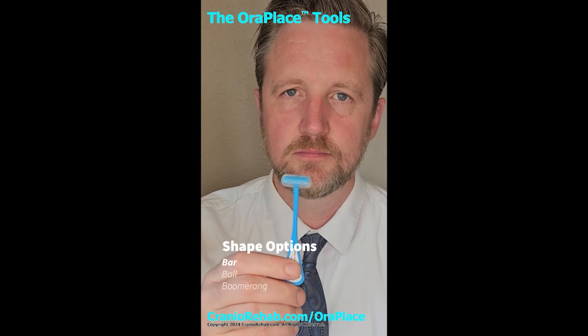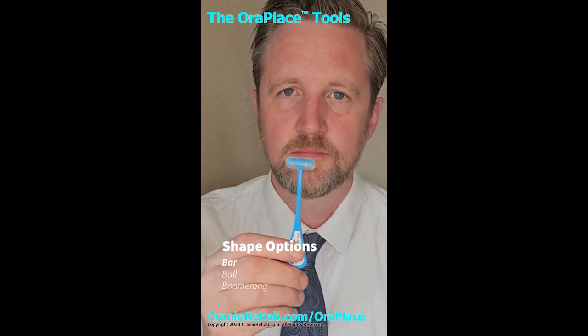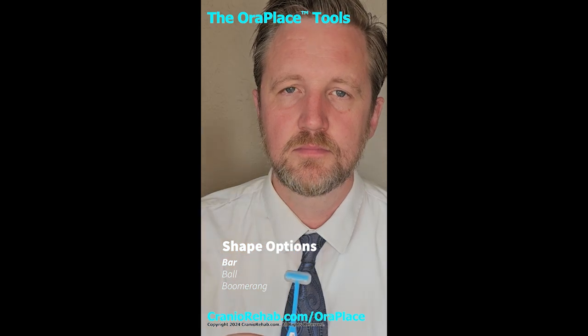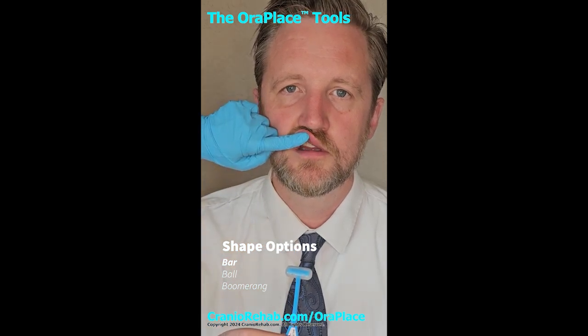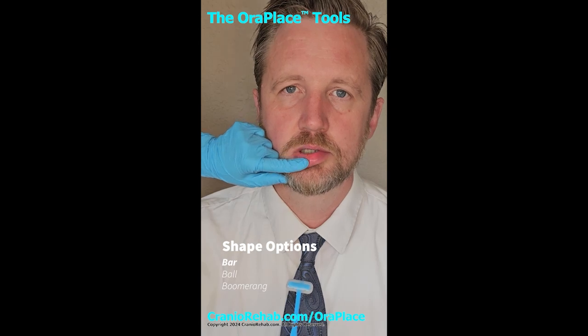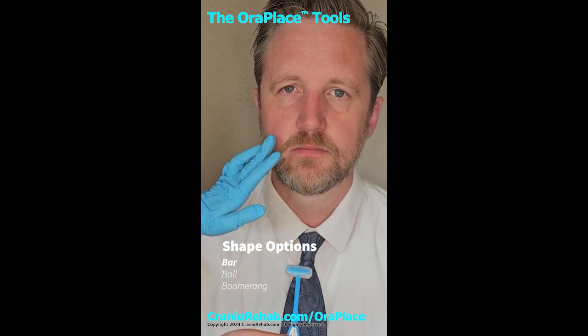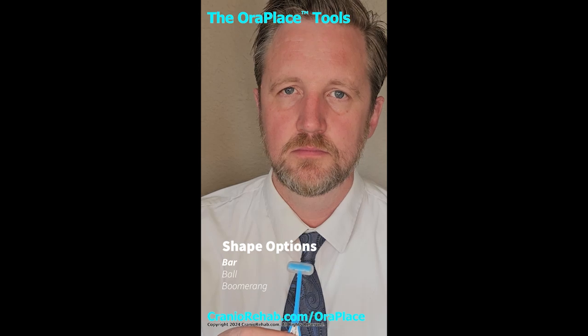Keep in mind the facial muscles often overlap and intercross. If you see that someone has an inverted upper lip where it rolls up, or an everted lower lip where it rolls down, this is because of tightening of the musculature in these areas. You may find that if the patient has a severely inverted lip, there is not much space to get a tool in there, so when you begin treatment, you may need to work the corner areas first until you can get down under the lip.